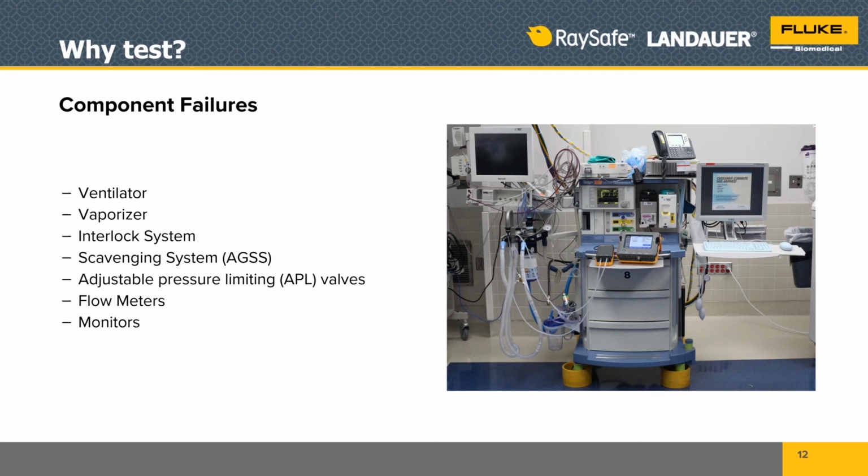So it is really important to have an adequate QA process for the entire anesthesia delivery system. Yeah. And ASA has guidelines around that.